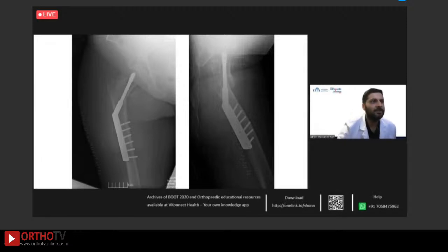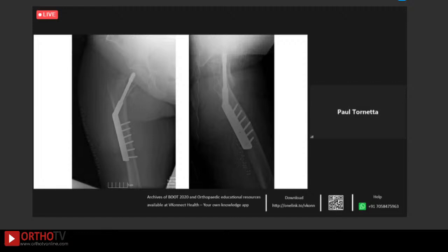So comments on this? She's only 3 weeks out from surgery and wounds look okay, no signs of infection, et cetera. So thoughts? Yeah, I mean, that's going to fail. I'm really conservative when people come in with stuff that doesn't look perfect. People get sent in all the time for this isn't healing on X-ray, and I tend to watch things for a long time. But this is not that case. This is malaligned. It's in varus. It's off in rotation, and it's short. So this one, unfortunately, is one that's going to need an acute reconstruction. And I would take it down at 3 weeks. You're going to be able to get an anatomic reduction probably just by doing it open. And I would get clamps on it and I would nail it.